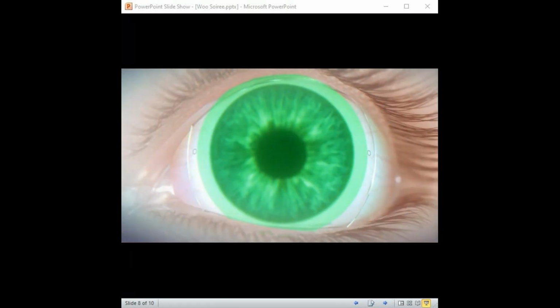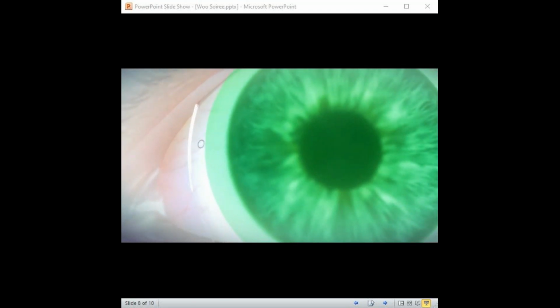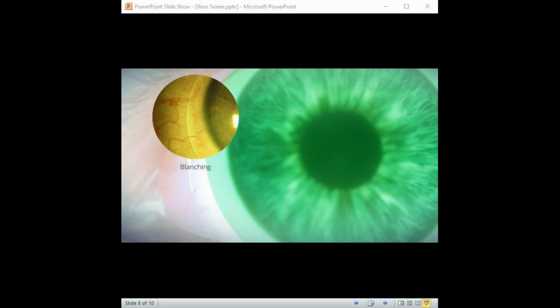Use the slit lamp with white light to observe the limbal clearance, which will show the limbal border and any fluorescein that is extending onto the sclera. Note if there is touch or minimal clearance present. Observe the scleral landing area, looking for edge standoff, blanching, or vessel constriction. If observed, note in the record.